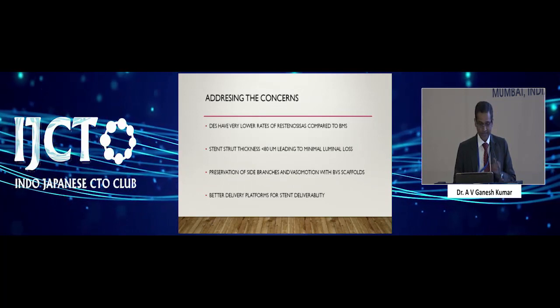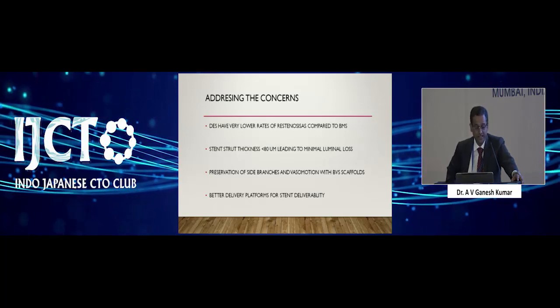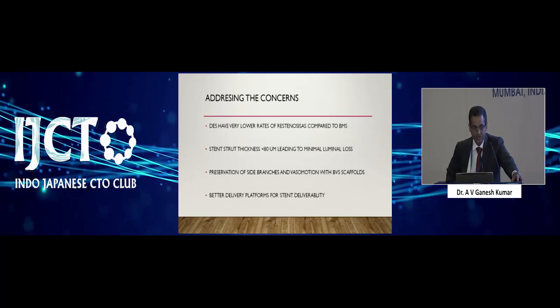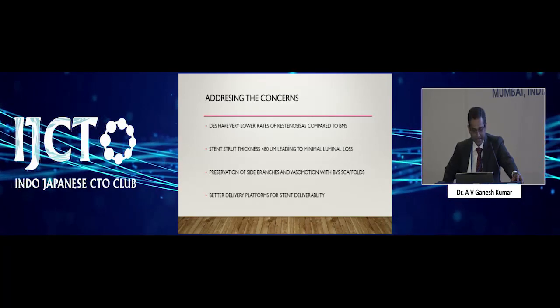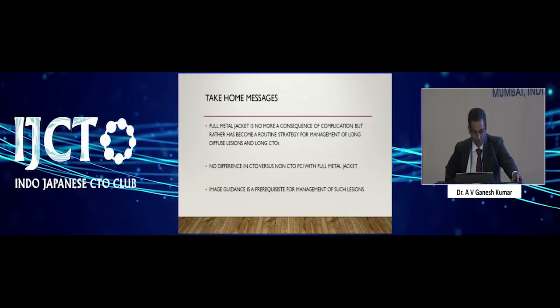So to address the concerns, DES have very low rates of restenosis compared to BMS. Yes, strut thickness of less than 80 microns, which we have now, will further lead to an improvement in full metal jackets. BVS data we don't have as yet as far as full metal jackets are concerned, and this might be a game changer, the BVS, we don't know.